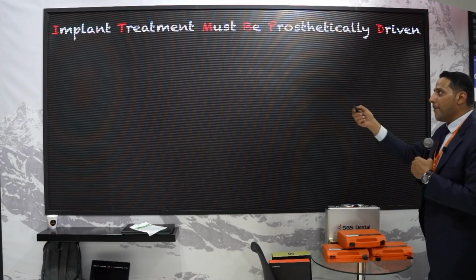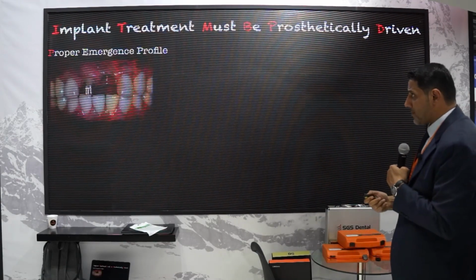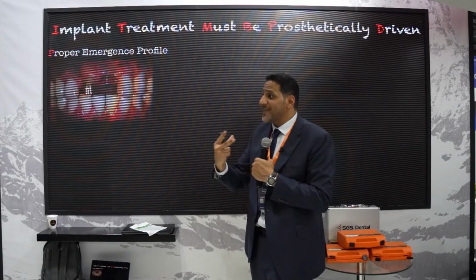Okay, again, implant treatment must be prosthetically driven. Why? First of all, you have a nice emergence profile. You will create a nice emergence profile, which is aesthetically pleasing.